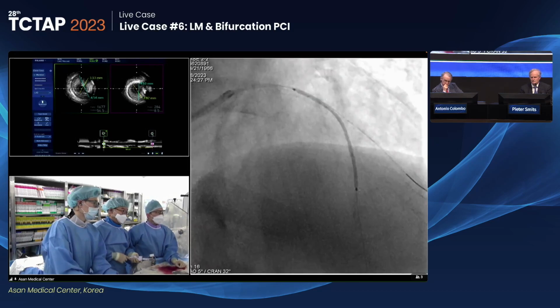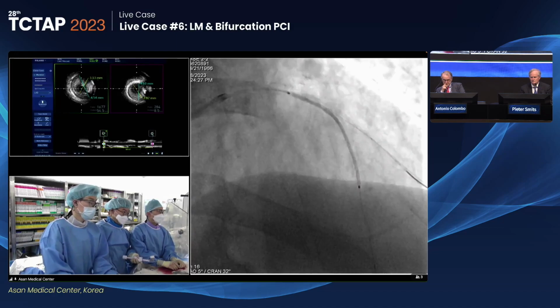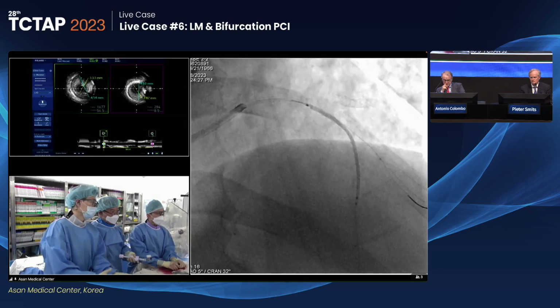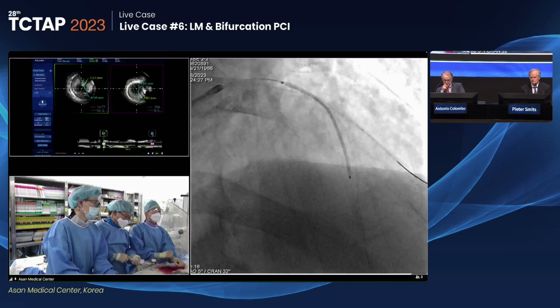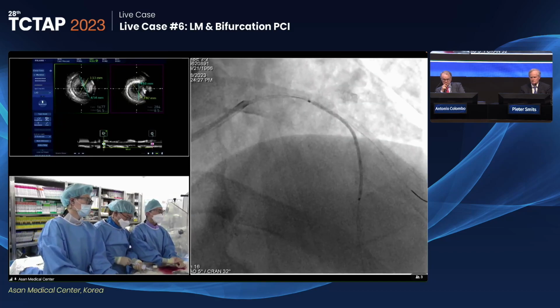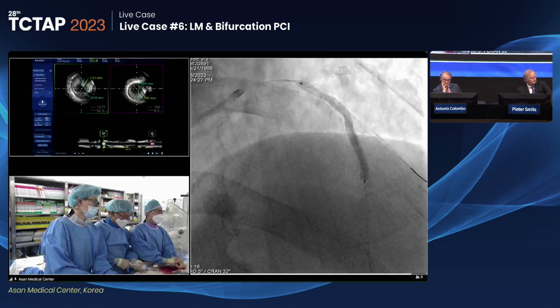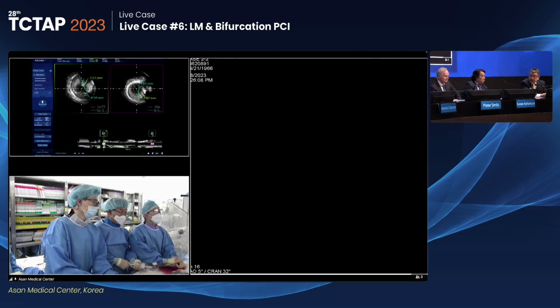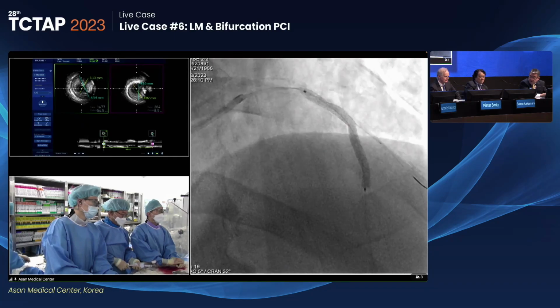So, Dr. Paul, call Hsien-Li. Yeah. Because of the wide discrepancy in vessel diameter between the distal LAD and the proximal LAD, would you prefer to use two relatively short stents or one very long stent? Which one is better? Well, I would size to the distal LAD and then max up the proximal part. Because if I use two stents, I might end up overlapping the diagonal ostium, which will cause even more trouble. And nowadays, these modern stents can be oversized significantly.